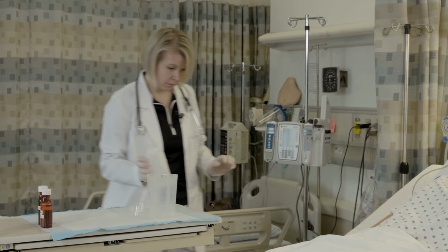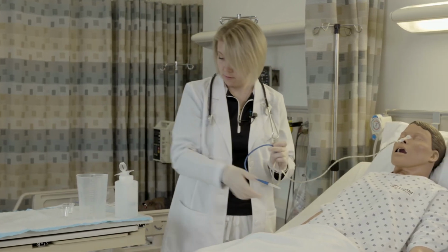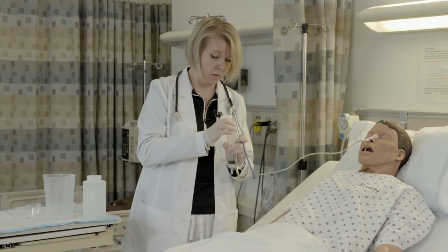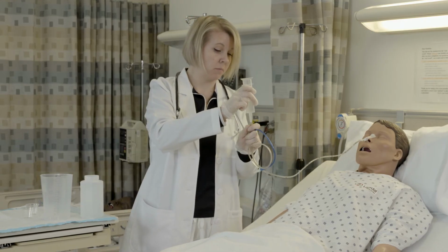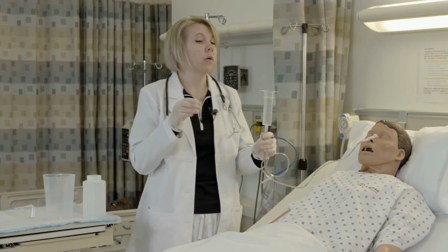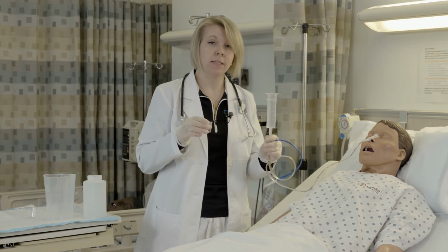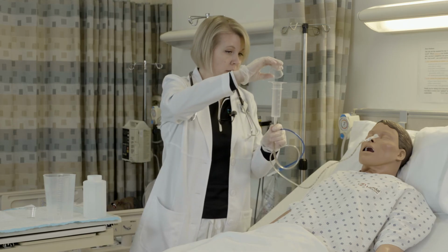Get all my medications prepared. I will take his NG. I am going to do this by gravity. So I will insert my syringe. First here I have his Depakote. I explained why he's getting the Depakote. I did my pre-assessments and I listened to his abdomen. I'll pour the medication in the syringe.